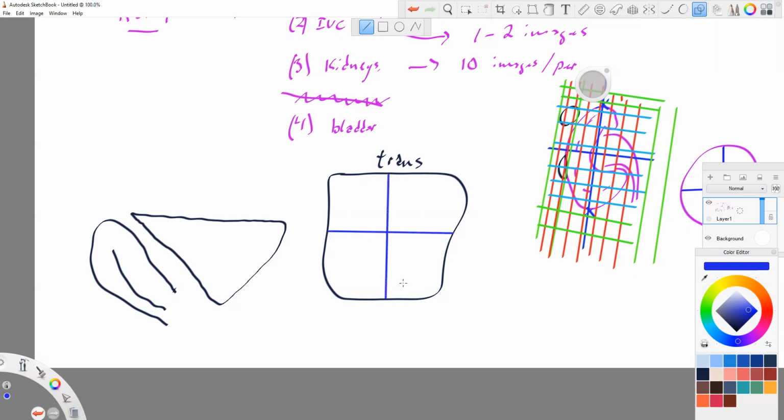Those are 2. And my third, well, here's the thing, guys. If I put my third up here, you could see where I'm kind of overestimating the volume, because that's obviously not a representative line for this entire thing. Just as if I put the line down here, I could be underestimating that volume. Does that make sense?